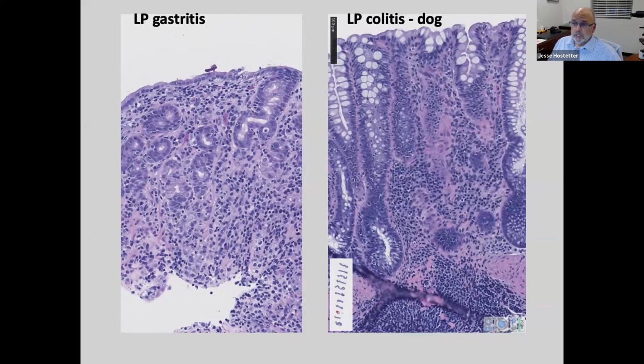if you're dealing with gut-associated lymphoid tissue, make sure you're not over-interpreting that as an inflammatory change. And so that can be tricky on endoscopic biopsies where your orientation is not great, but usually that cellular infiltrate is pretty well delineated, and it can be very dense, and then that tapers off and has a boundary that you can assess.